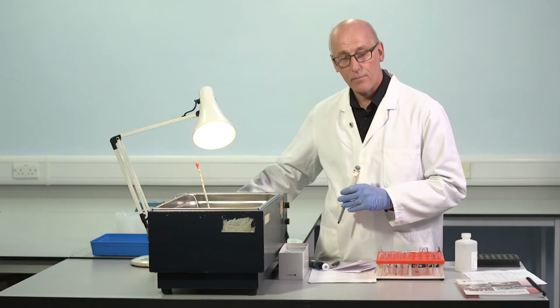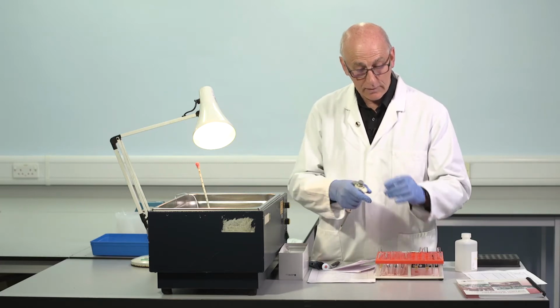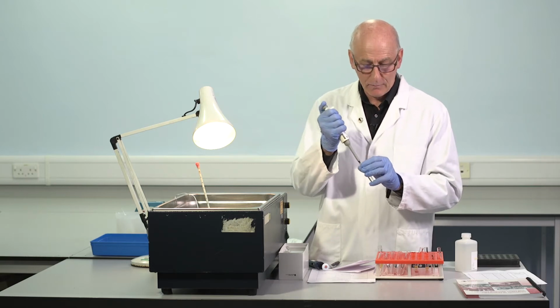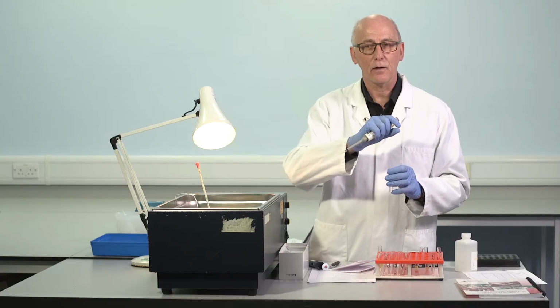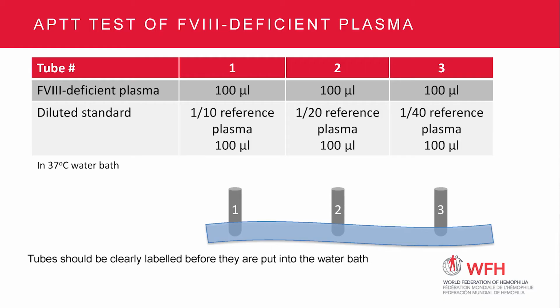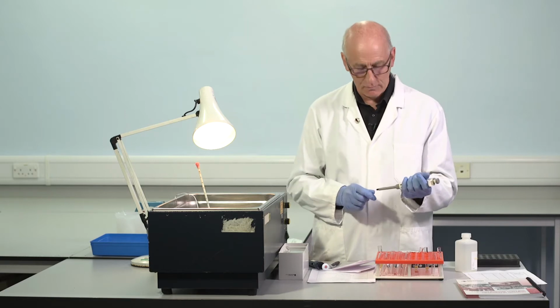And in the third tube, 0.1, 1 in 40. So each tube contains the same volume of factor VIII deficient plasma, providing the same level of clotting factors in excess. The dilutions of the standard contain different concentrations of factor VIII, 1 in 10, 1 in 20, 1 in 40. So we've added different amounts of factor VIII to each of those tubes, and that will have a different impact on the APTT of the factor VIII deficient plasma.